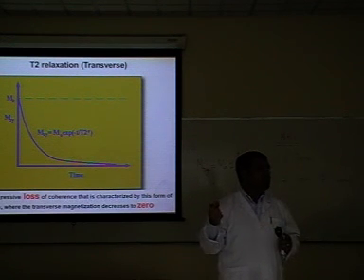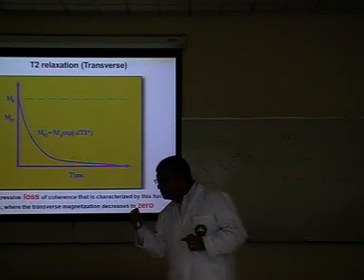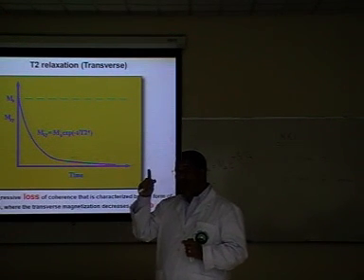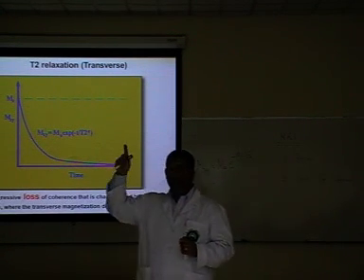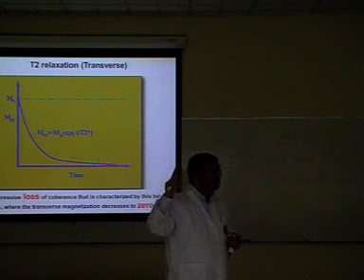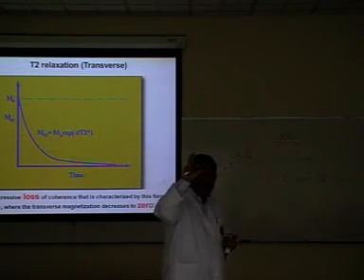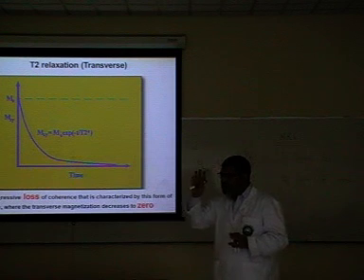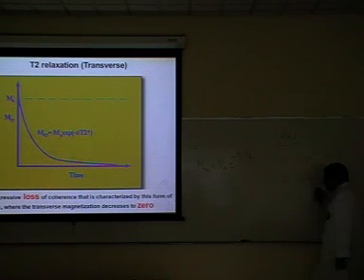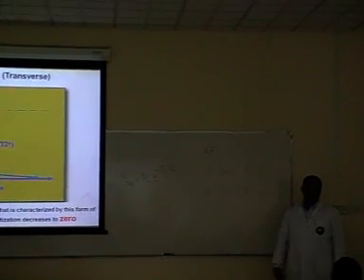How do we calculate the precession frequency? F is equal to gamma multiplied by B0, the magnetic field. And remember, gamma, the gyromagnetic ratio, is constant. So once we apply the RF signal, we are sorting out business, except we're not there yet.